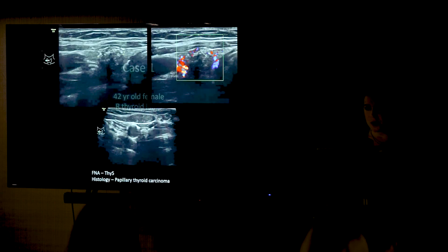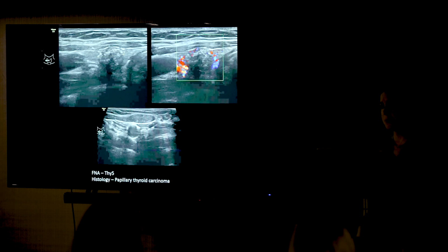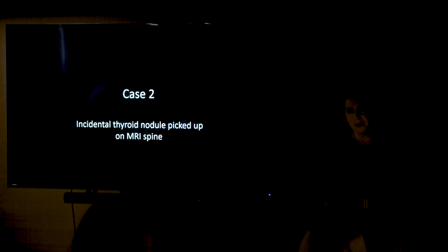That's fine, right. So this one, the FNA cytology, so it's echogenic foci, calcification. It doesn't look like colloid artifact. It's quite small. She actually had on neck dissection tiny micrometastases, and the histology is a papillary thyroid carcinoma. And she was young, so 42. She came with a separate benign thyroid lump, as is the way, but we found this small thing that she didn't know was there.